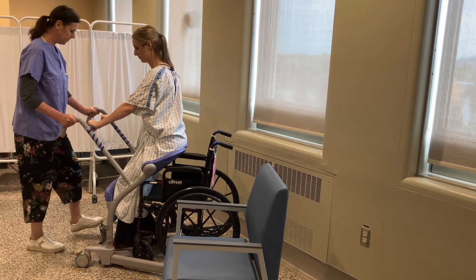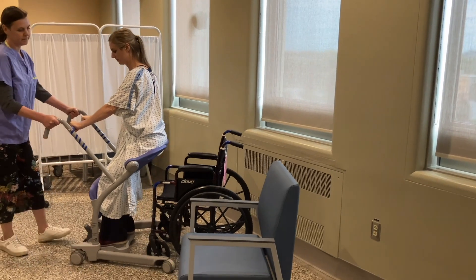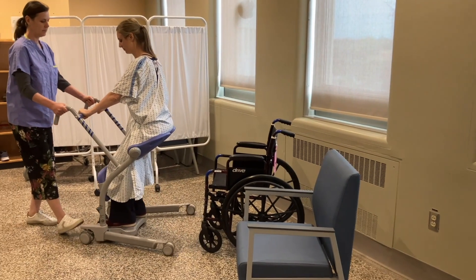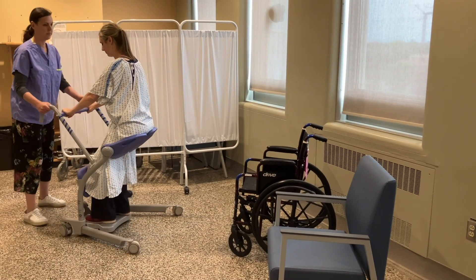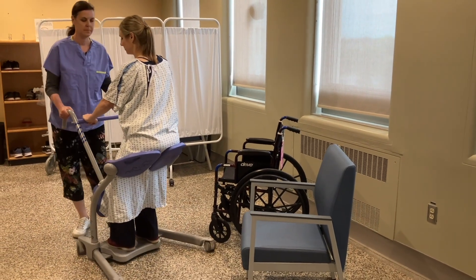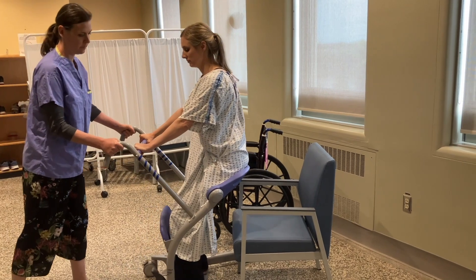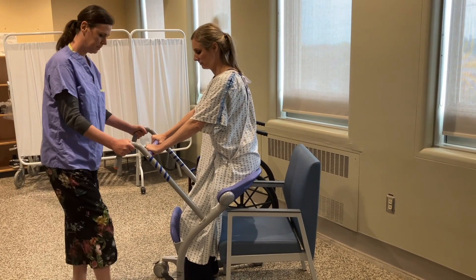The brakes are then released and the patient can be moved to the surface you wish to transfer them to. Keep your core tight and use your legs and body weight to push the Sarah Steady. If you were bringing a patient to the commode, you could push the commode behind the patient instead of manoeuvring the Sarah Steady.